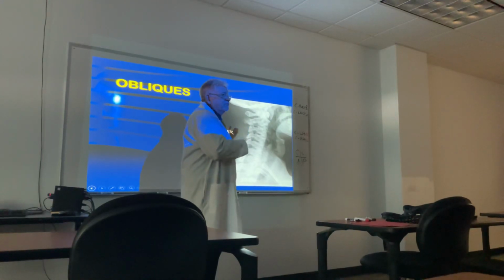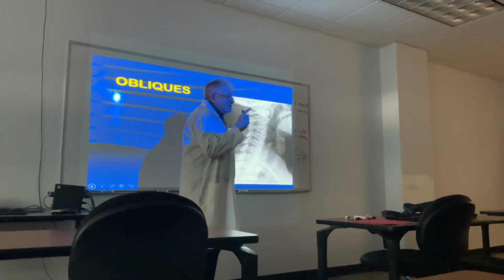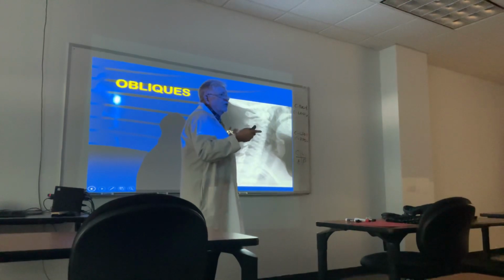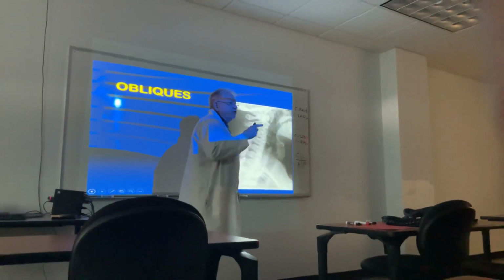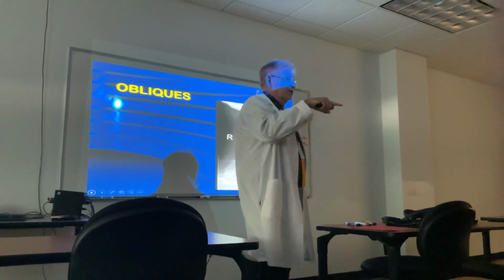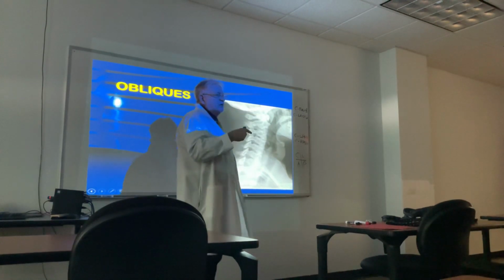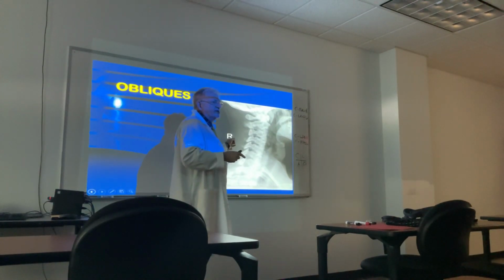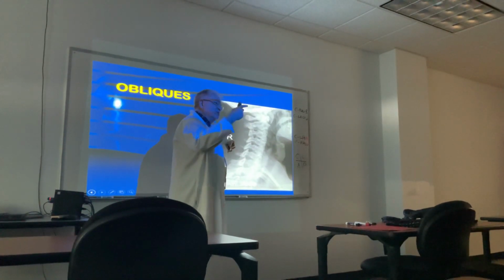So if I get this, I'll just redo their X-rays, because clearly I didn't take them correctly. That's one way to protect yourself. Or you can just digitally erase this, subtract it, and put the correct one on. But your document should say, the marker was incorrect, I put on the appropriate one. Digitally, that's where we get into trouble, the hackers can go in and change all your right markers to left. Now all your records are incorrect. That's how the hackers can do this.